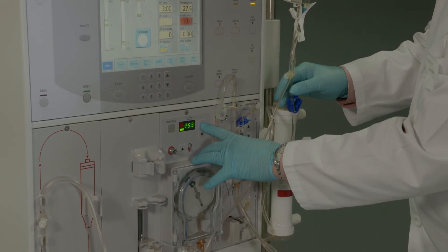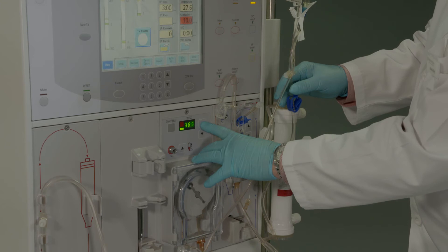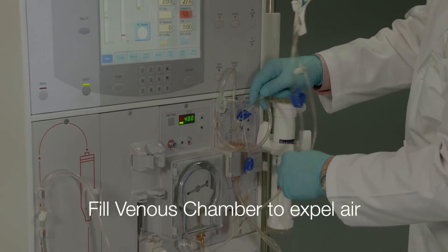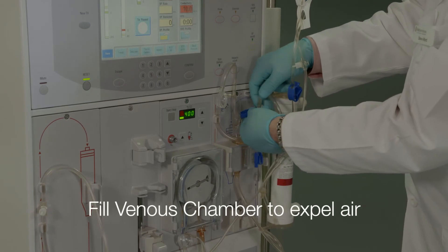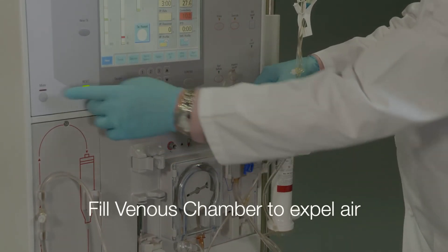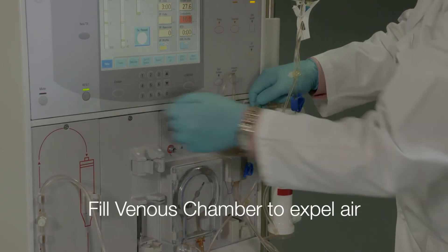Press the start/stop key to start the blood pump and set to 400 milliliters per minute. Fill the venous chamber with saline using the level adjust medication line to expel all air from the chamber and place the line in the line clamp optical detector. Reset the level detector alarm.